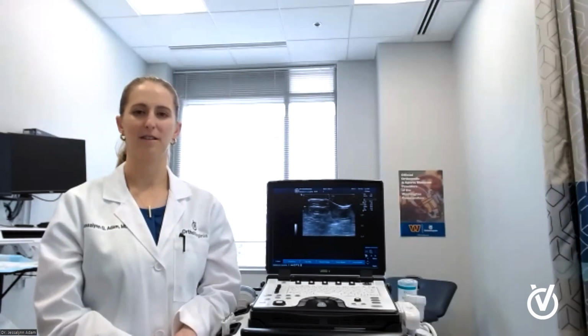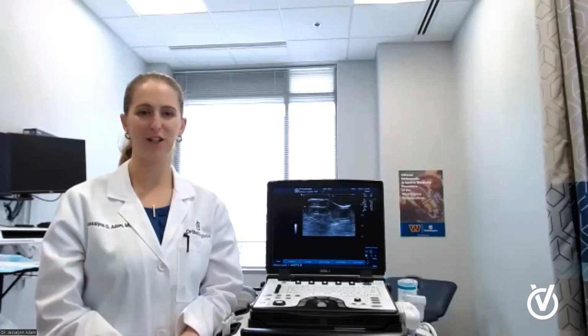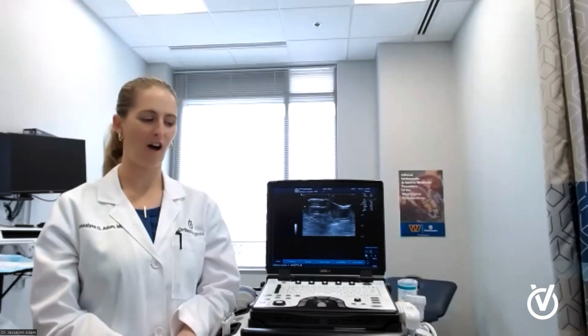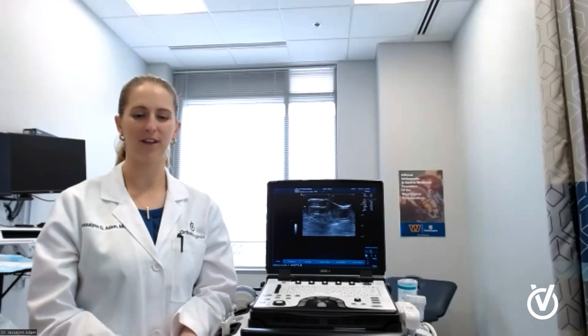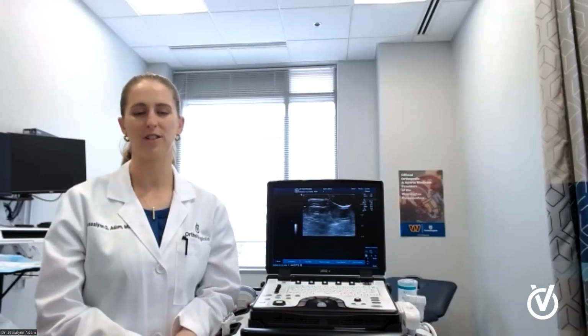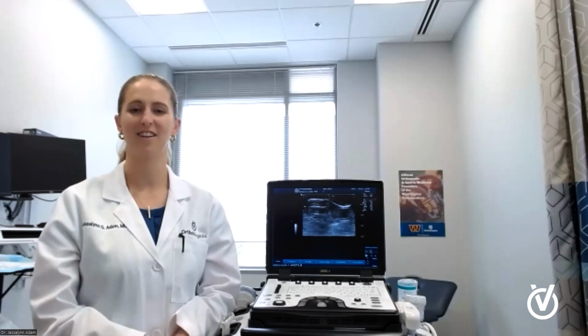Thank you. Does it require a referral? No, it does not. So the ultrasound comes with me every day to my office and into almost every room with me. And if it's a problem where I think ultrasound would be beneficial, then I discuss that and we do the ultrasound right then and there.